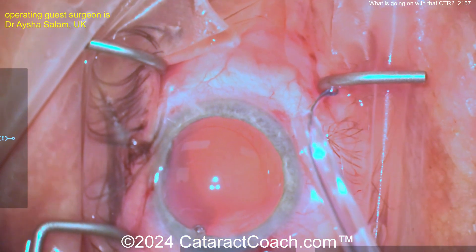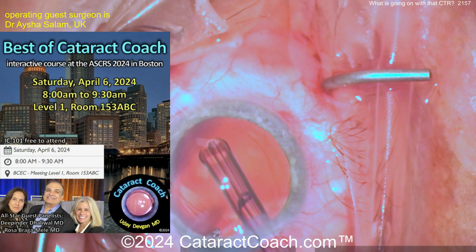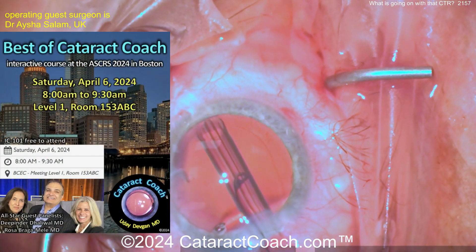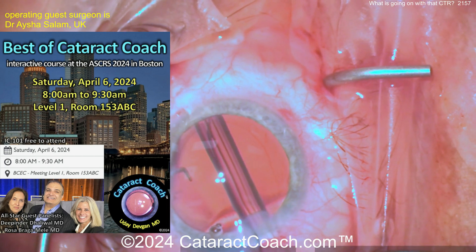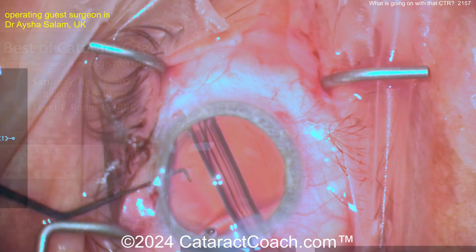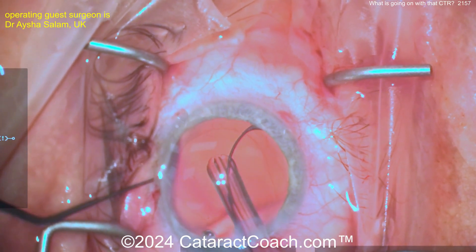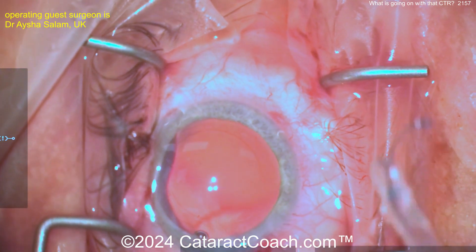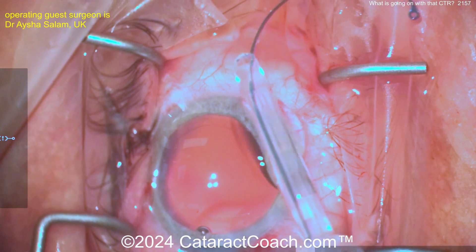It's okay to do a do-over. We've got our Best of Cataract Coach coming up this Saturday, April 6th, 8 a.m. at the ASCRS meeting. If you're going to be at the meeting, I'll see you there bright and early — it sells out every year even though it's free, standing room only, so get there early. I always start on time. So again, yet another failed attempt — it's coming out in the wrong direction.